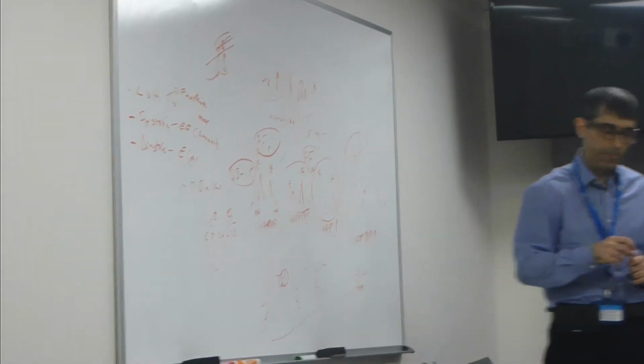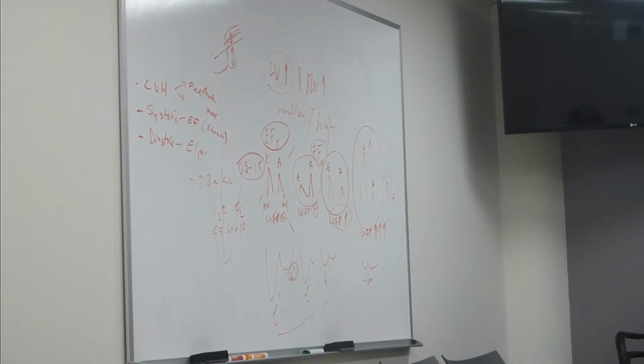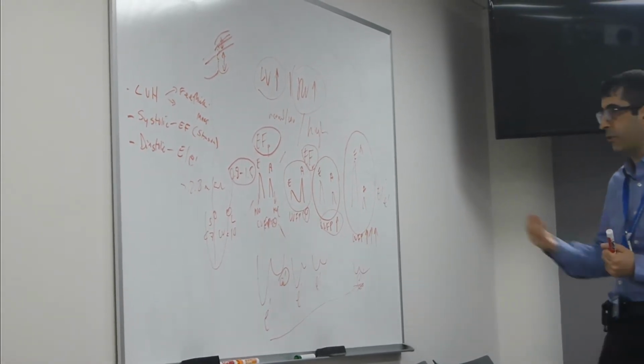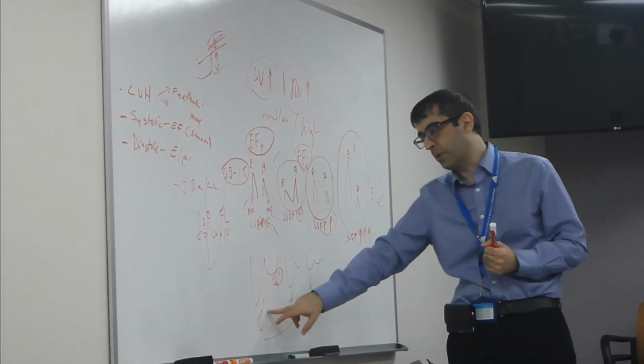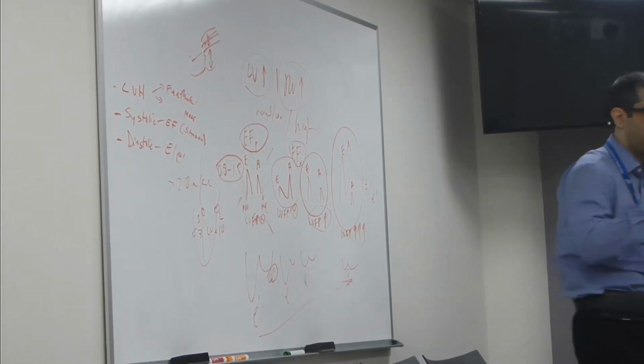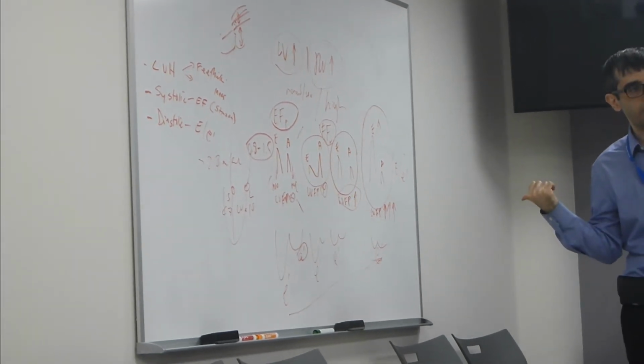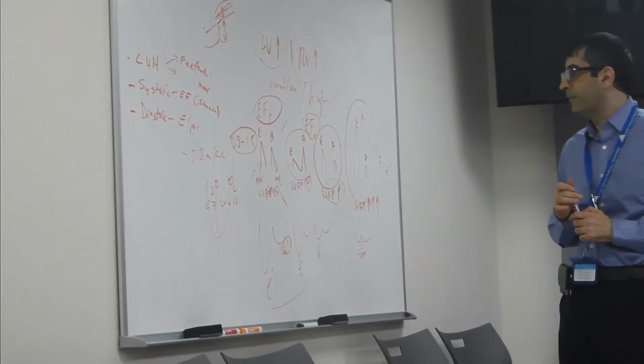It doesn't work in patients with rheumatic heart disease who have significant mitral stenosis, because your E velocity is going to be elevated and your E prime is going to be down anyway. So it's also important to know your exceptions to this diastolic quantification.